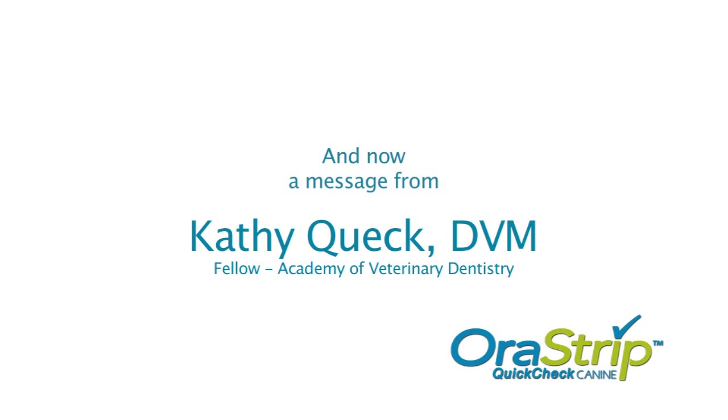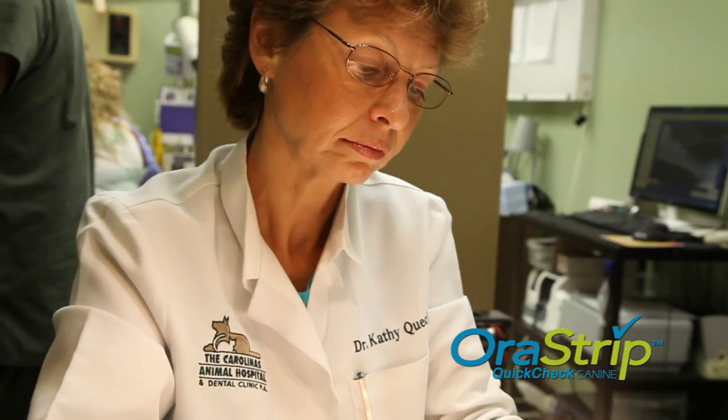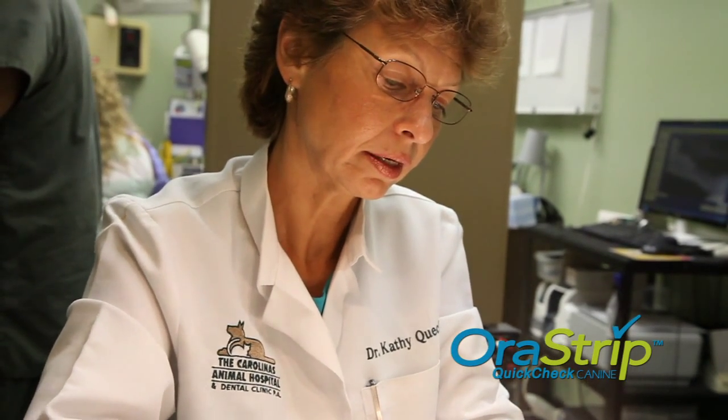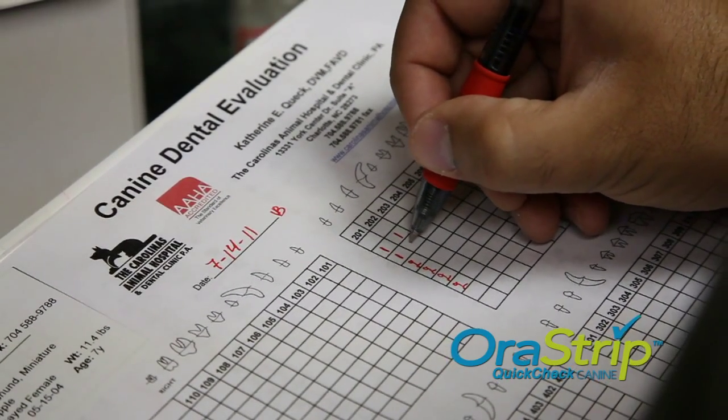The great thing about the OraStrip is that it identifies disease early on so that we can catch it before it progresses to periodontitis. And so that's where I see the real benefit in our practice situation, is that we can help these animals from actually developing the disease, and we may not recognize it visually.